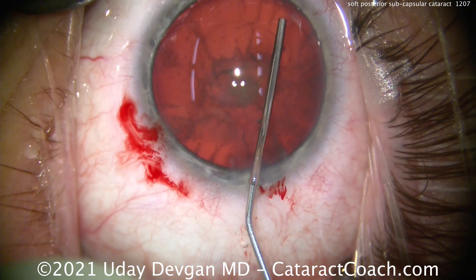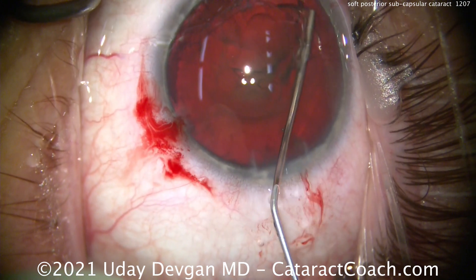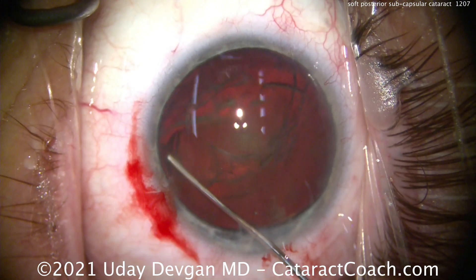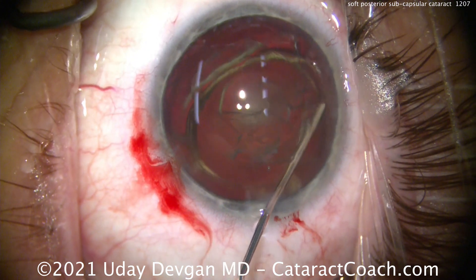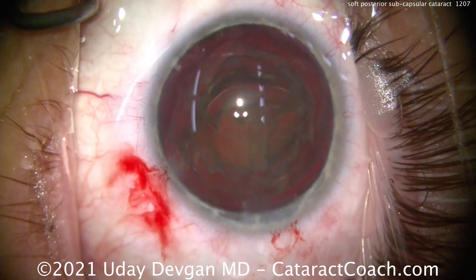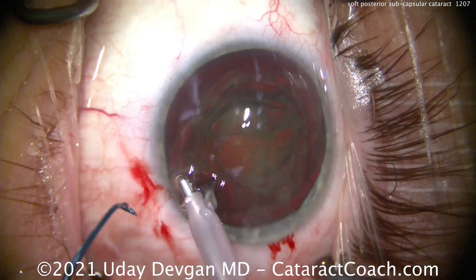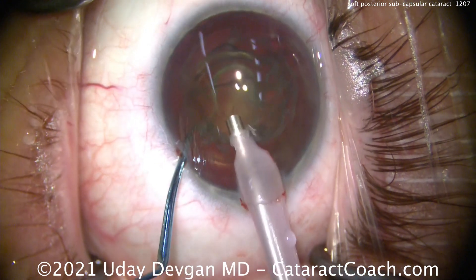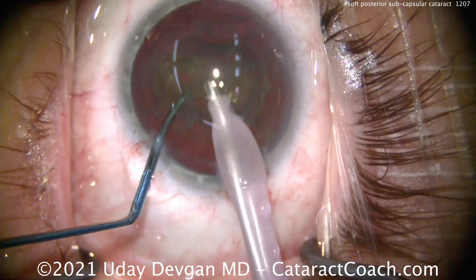With a soft lens like this there is no nuclear sclerosis and no nuclear density, so we hydrodissect extensively and do hydro-delineation repeatedly to free the nucleus and lens away from the bag. With a lens this soft, you really don't need any phaco energy — don't go in the eye and start buzzing on the foot pedal, because that risks damaging the capsule. Going in with the phaco probe now using zero ultrasound energy.